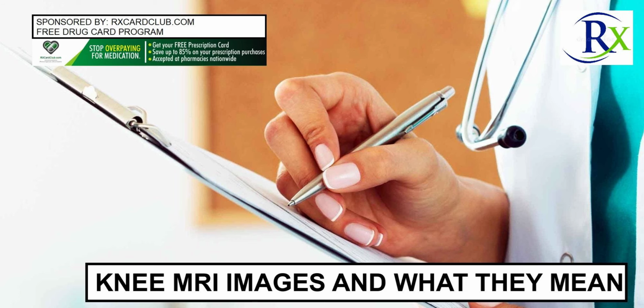Certain abnormalities will be listed on an MRI report as an intrasubstance signal. This doesn't mean that the meniscus is necessarily torn, it simply tells us that the meniscus isn't appearing as it should. Intrasubstance signal could be caused by normal aging or an increased vascularity commonly seen in children and young adults. Further investigation would be needed to reach a definitive diagnosis.